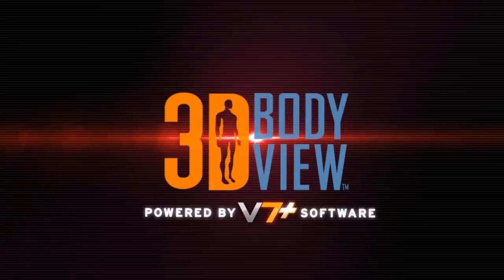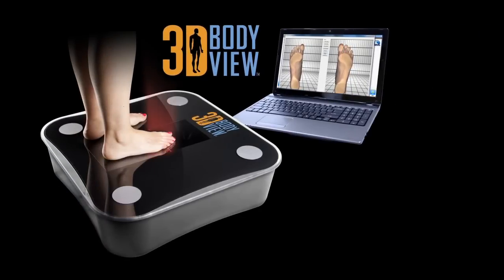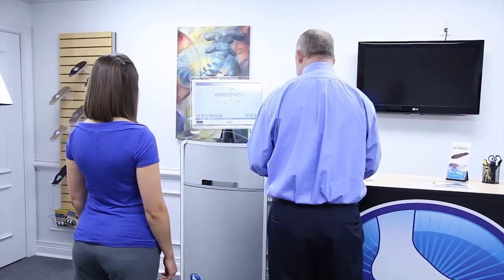3D BodyView, powered by V7 Plus software. 3D BodyView is the latest in three-dimensional imaging for patient assessments, so that doctors and patients can see how their feet can affect their entire body. Join us as we take a look at this exciting new system.